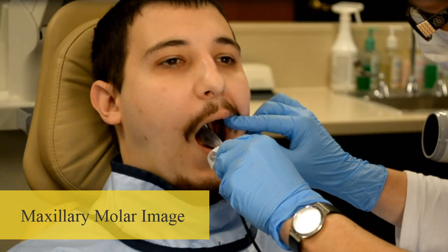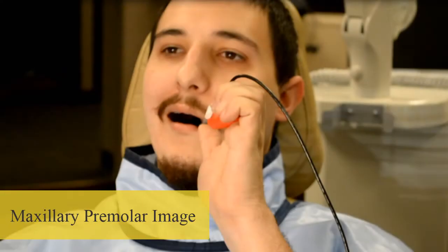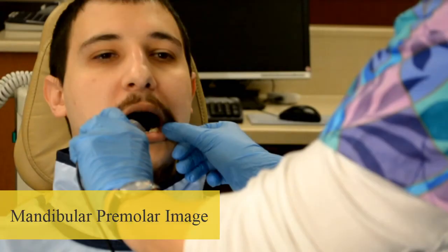Maxillary Molar Image. Maxillary Premolar Image. Mandibular Molar Image. Mandibular Premolar Image.